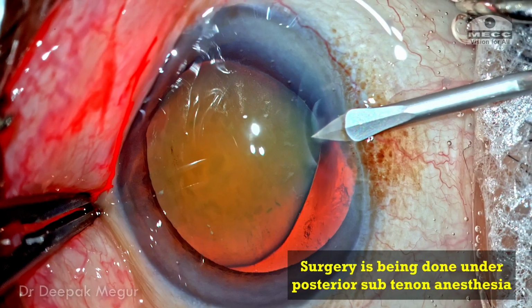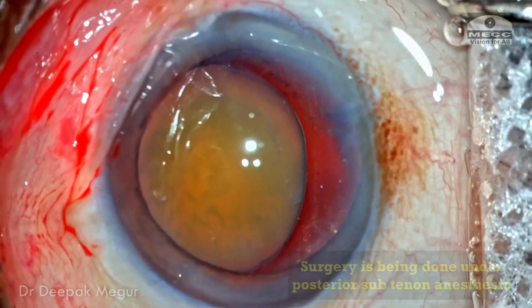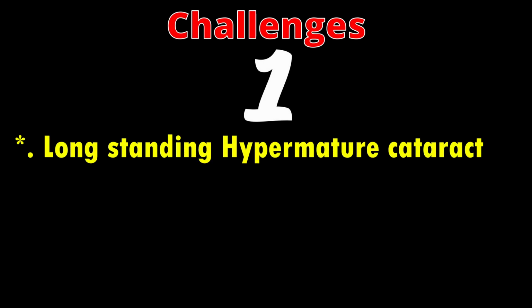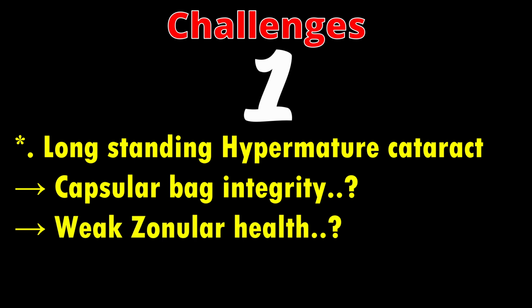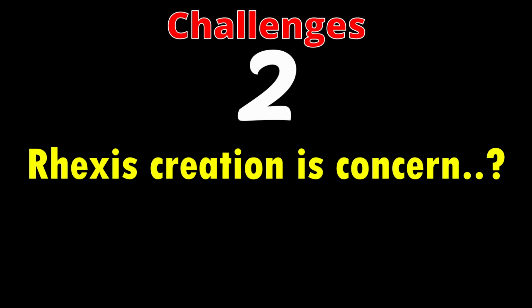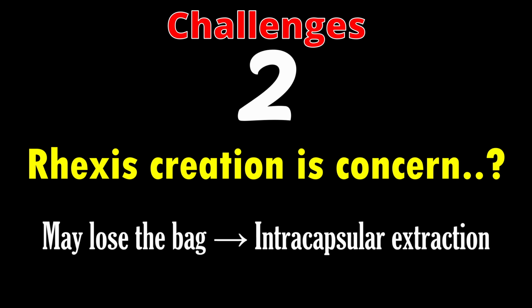The surgery is being done under posterior subtenon anesthesia. Now let me pause for a moment and try to write down what are the challenges which I'm going to expect in this case. Number one, this is a long-standing hypermature cataract. So the integrity of the capsular bag and the zonules and their strength is going to be questionable. Whether I'll be able to perform rhexis with this weak capsule is a second question, and there's more likelihood that I may lose the bag and it might turn out to be an intracapsular extraction. So I've kept all my options open.